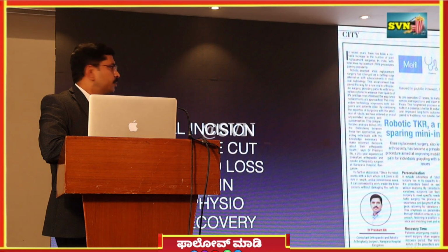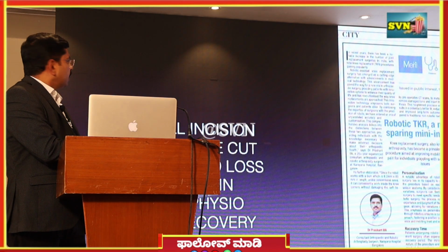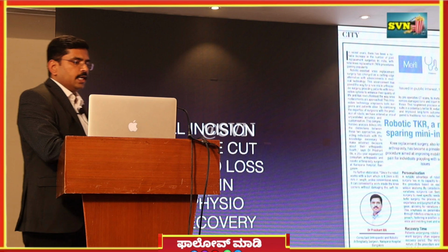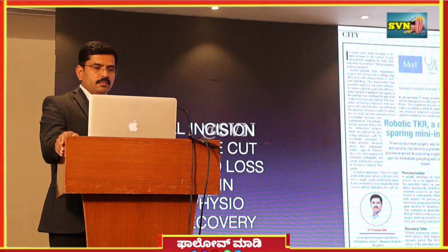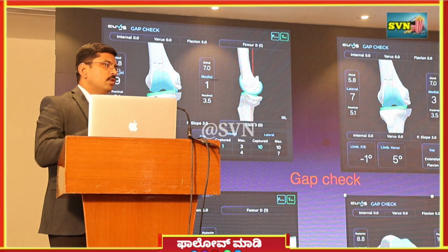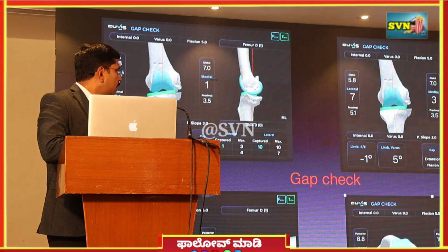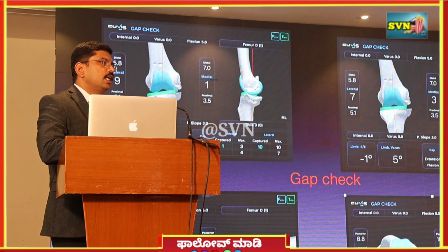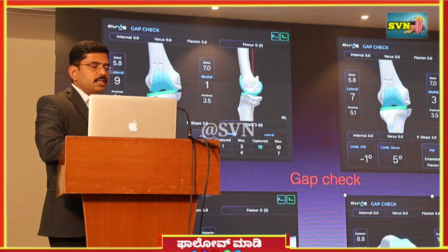The same thing I had explained in an article, where this surgery has the advantage of small incision, no muscle cut, less blood loss, less pain, less physio, and fast recovery. So during the surgery, before we put the implant in, we have to plan the surgery, and we see the planning is done for the bone part. Then we see how it coordinates with the soft tissue part, how the ligaments are balanced. So that's what happens on the table. Once this balancing is done, then the robo does the surgery.